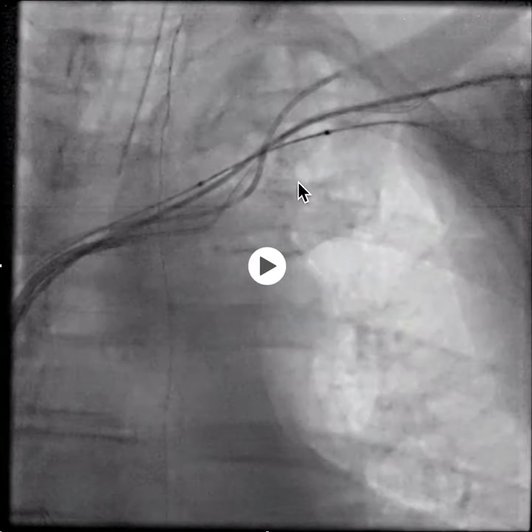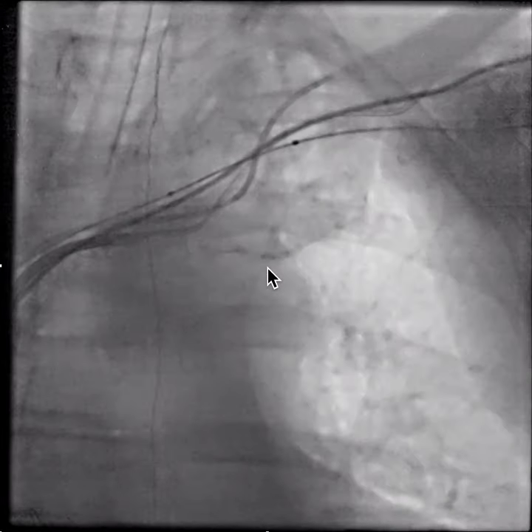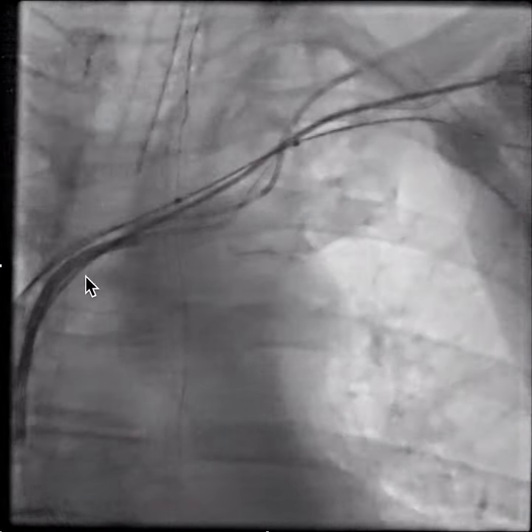In this situation, we would have probably been better off to put a balloon over the .018 wire, because the lumen of the balloon will ultimately determine the minimum outside diameter. In short, if we had left the .018 wire down and selected a balloon that would go over an .018 wire, instead of putting down the AMPLATZ .035 wire, we would have had an easier time getting the balloon through the occlusion.